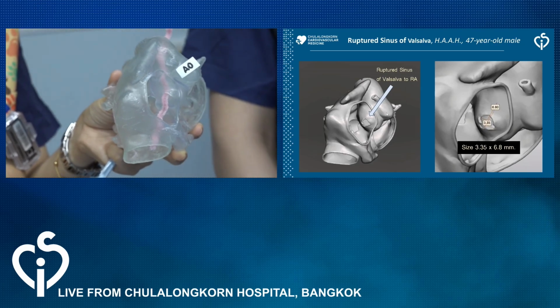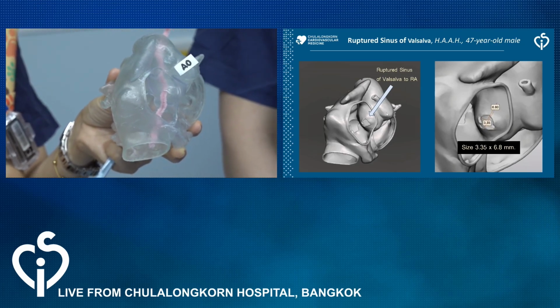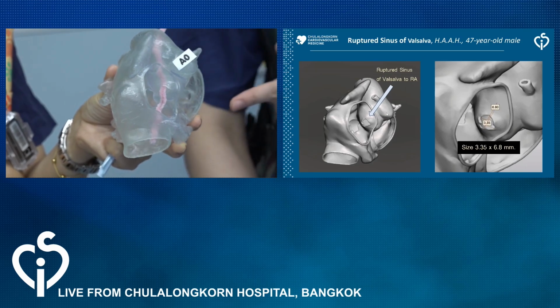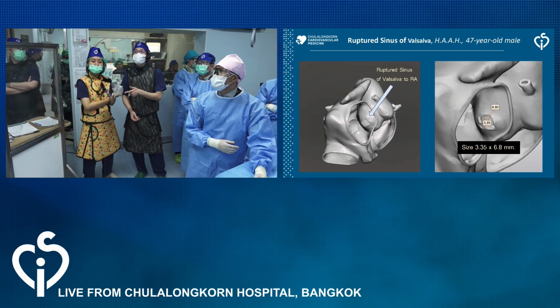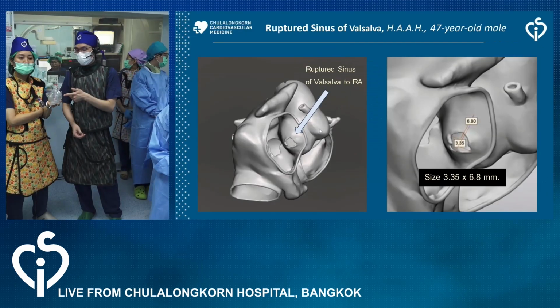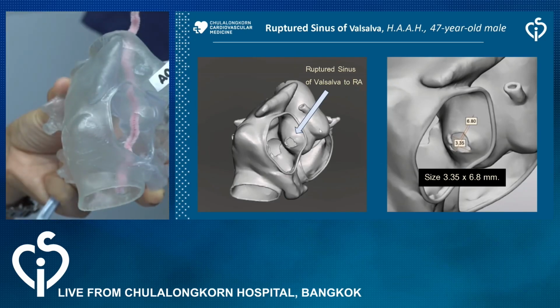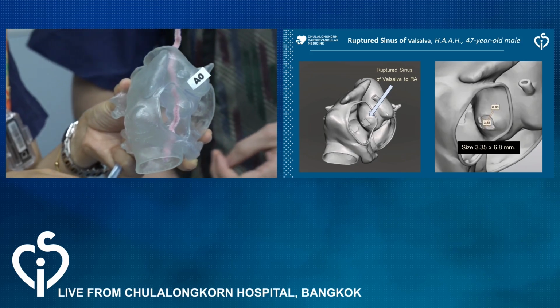Okay, we see that the defect was about 3.35 by 6.8 millimeters, and here is the real thing. We will print it to the model, and Dr. Pontep will demonstrate the model for us.